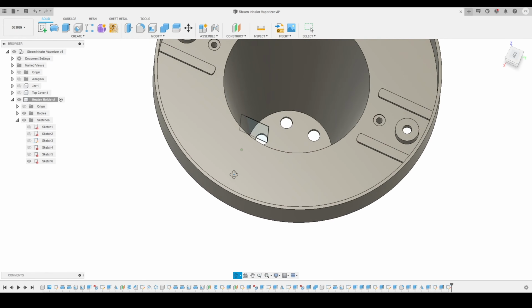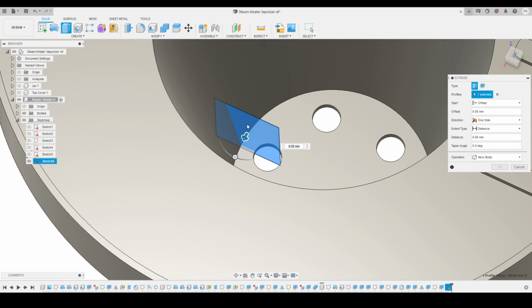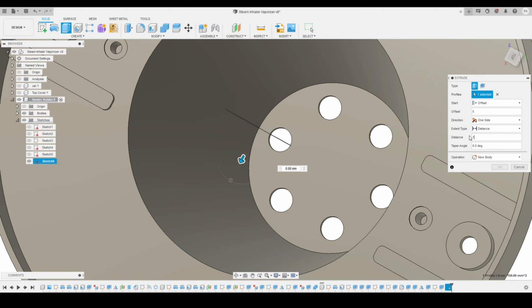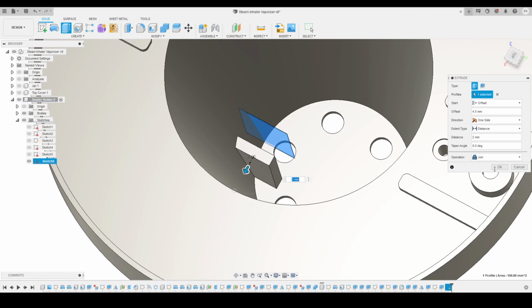I will click on finish sketch, and here you can see this is the profile we got. We'll activate the extrude tool, select the profile, and now we're going to extrude this on both sides. We're going to offset this by 5 millimeters. We just don't want to start it from the exact plane. I had offset it by 5 millimeters, and the extrude distance I'm giving is 2 millimeters. Here you can see I'm adjusting the offset a little bit, maybe 4.5, a little closer to the plane. And instead of cut, I will make sure that it is join, and will press OK to accept.